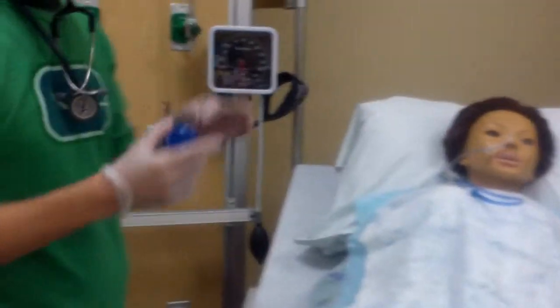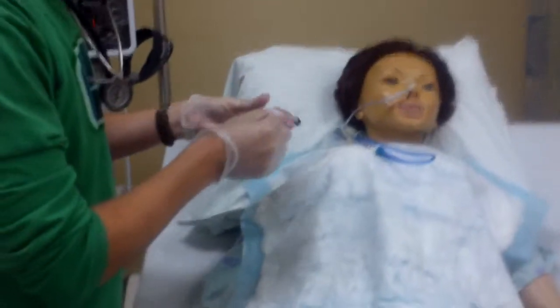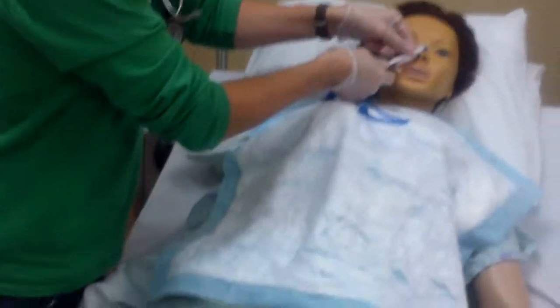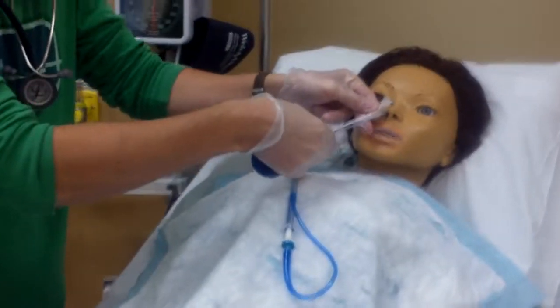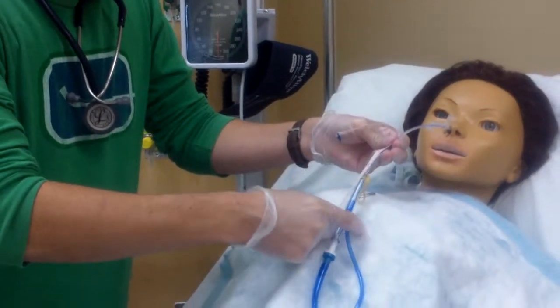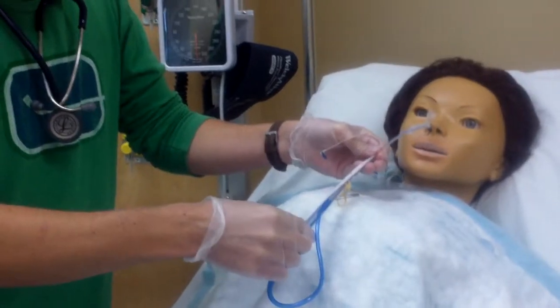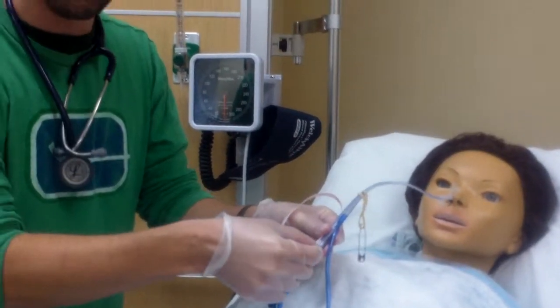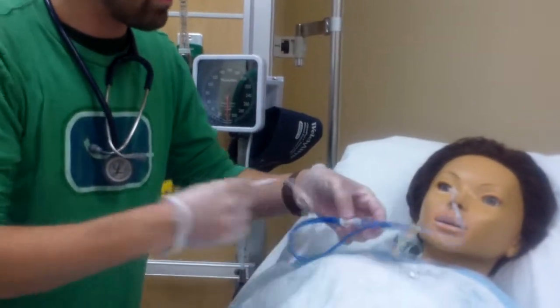Okay, so now I need to check the placement of it. So I got my little tape measure here. I'll go to the tip of the nose, measuring this going down. There you go. Get that away from your face. Going all the way down and noticing that it is about 10.5 inches, which matches up to my nurse's notes. So I know how long it is, so that's good.